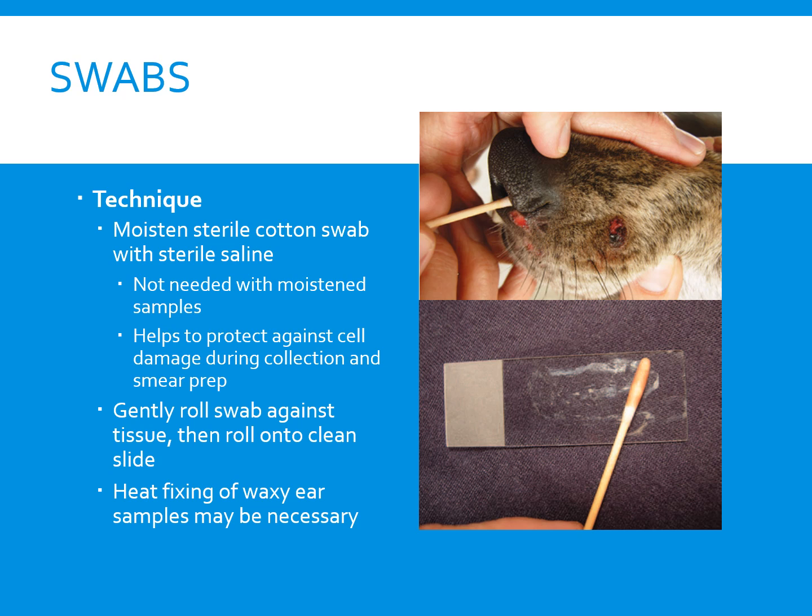For the collection of vaginal swabs, the animal needs to be restrained in a standing position with the tail elevated. The vulva needs to be rinsed and cleaned, and then using a speculum that's lubricated or a plastic tube, it gets inserted just cranial to the urethral orifice in the vagina, and the cells that are collected are those that have exfoliated or shed from the vaginal wall, like epithelial cells and neutrophils, or red blood cells that are passing through the vagina during proestrus or estrus in the female.